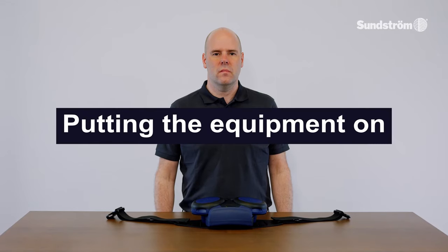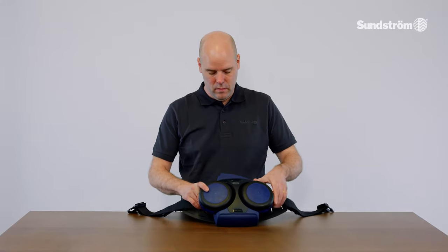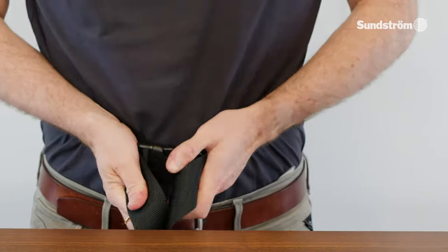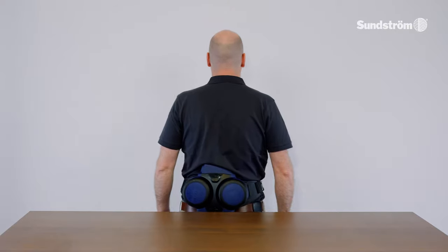Putting the equipment on. Before putting the equipment on, read carefully the user instructions for the head top. After the filter has been fitted, a performance check has been carried out and the head top has been connected, the equipment can be put on. Snap the two parts of the buckle together and tighten the belt so that it is comfortable. The fan should be firmly in contact with the wearer's back to ensure optimum comfort and ergonomic benefits.